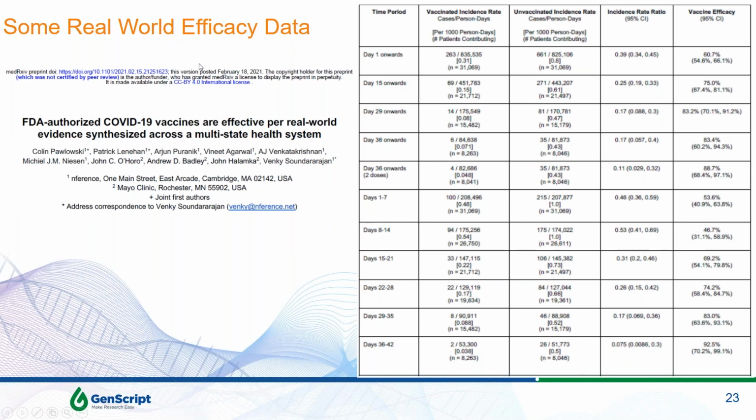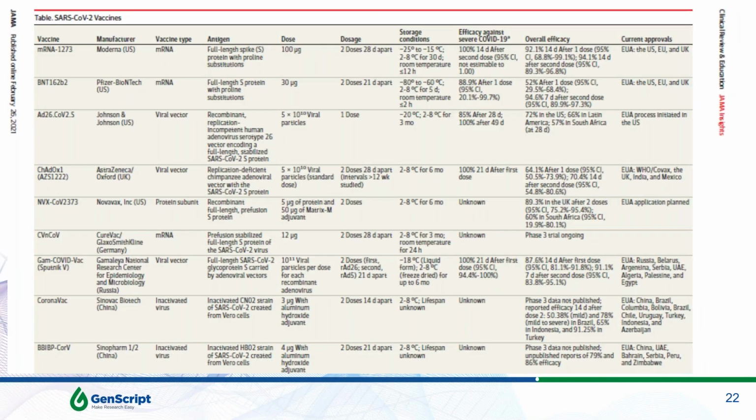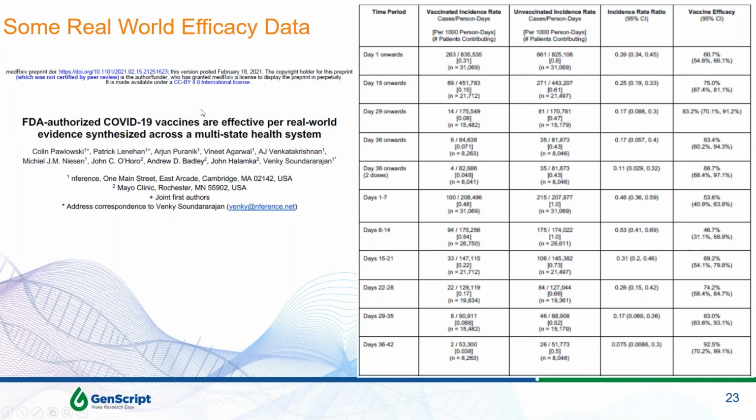So this is, again, some real-world data. This table is really just manufacturer claims, and I'm sure based on data from the manufacturers. Here's a study from the Mayo Clinic where they looked at the Moderna and Pfizer vaccines combined together, and it shows that the efficacy results for the Pfizer and Moderna vaccines at days post-vaccination change quite dramatically as we go through these results. And if it's this low after vaccination, especially after one or two doses, it begs the question: should I get some sort of confirmation test so that I know I'm protected post-vaccination, and that I'm generating antibodies, especially neutralizing antibodies? So these are data from the Mayo Clinic, and there are other data from Israel and the UK as well that corroborate these data.